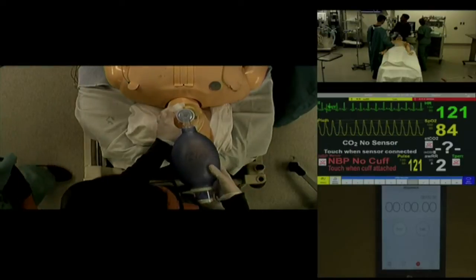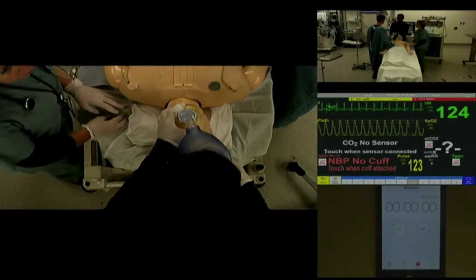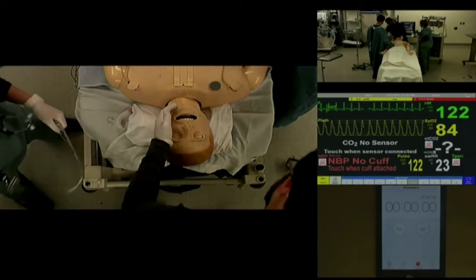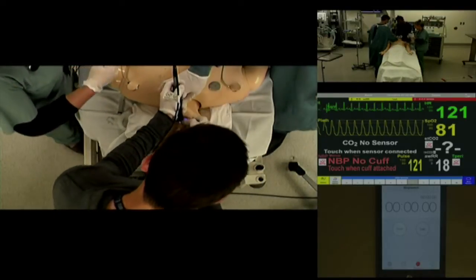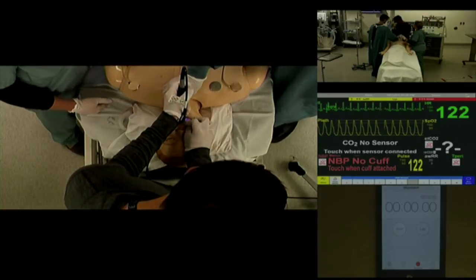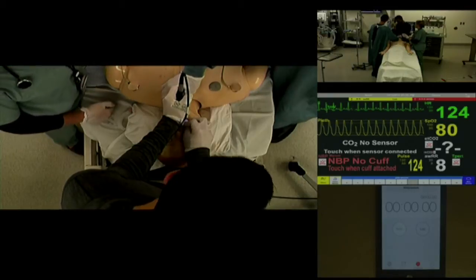All right, the best I can do bagging the patient is about 84%. I'm going to try my third attempt now with the GlideScope. Can you get ready to provide some backwards upwards pressure? And with the GlideScope, pretty limited view still.